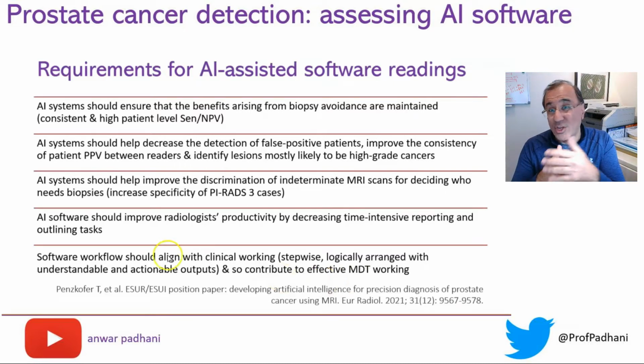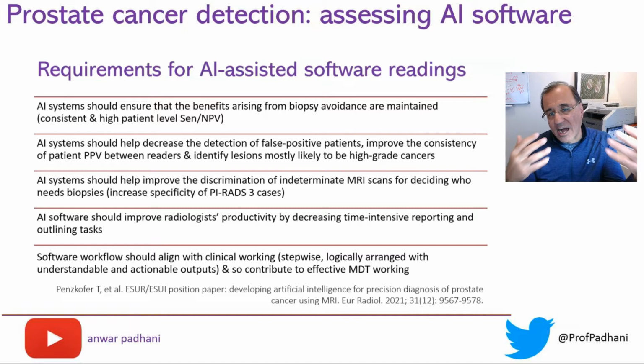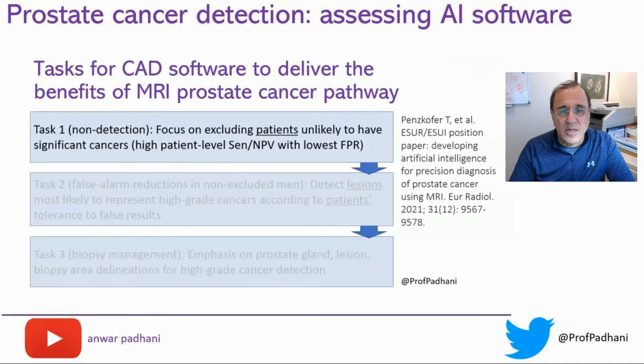AI should help you in your productivity by decreasing these time-intensive reporting and outlining tasks. And of course, the AI should be logical and stepwise so that the outputs are actionable and therefore contribute effectively to MDT working. So we can really think about 3 major tasks for an MRI.